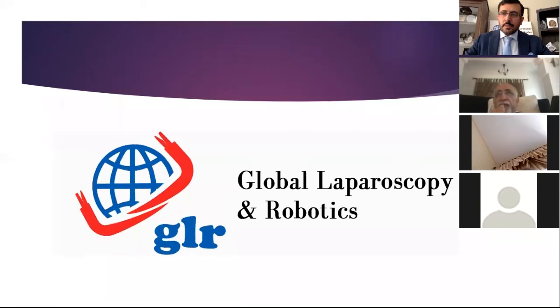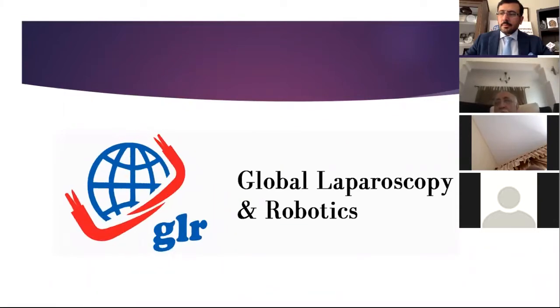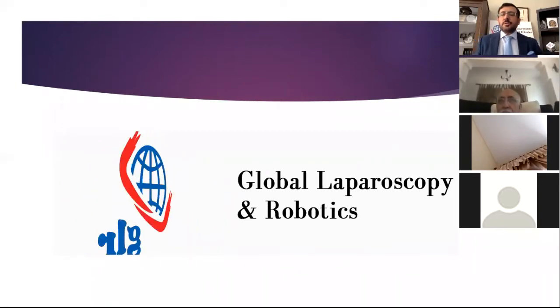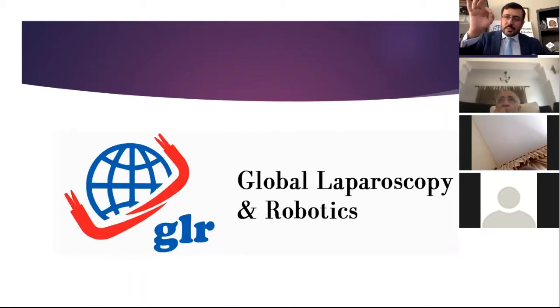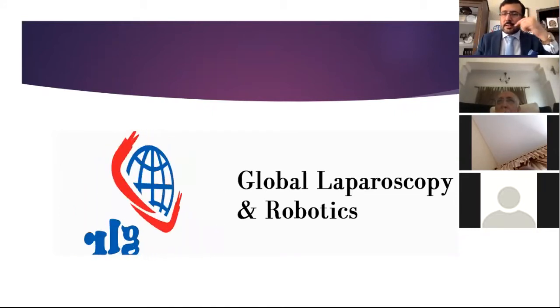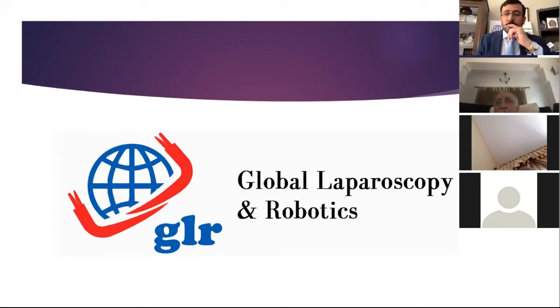Sir, you will answer? No, Imran, I'll leave it to you. I've got no experience of using laser in laparoscopic surgery, so to be honest, I can't answer the question. Dr. Mohsin, same. But sometimes we use RF in liver mets, where we put the electrode inside. That is not laser. But routinely, there is no role of laser in laparoscopy. Okay, thank you.